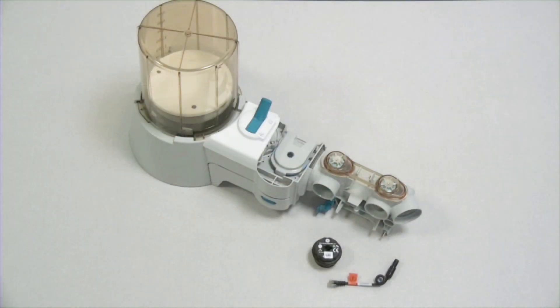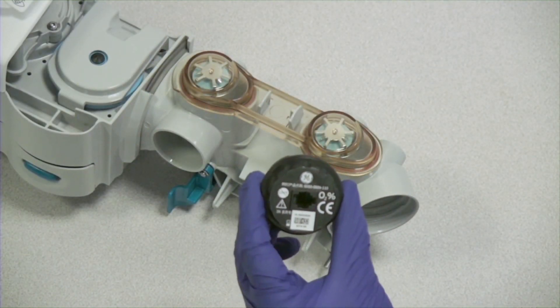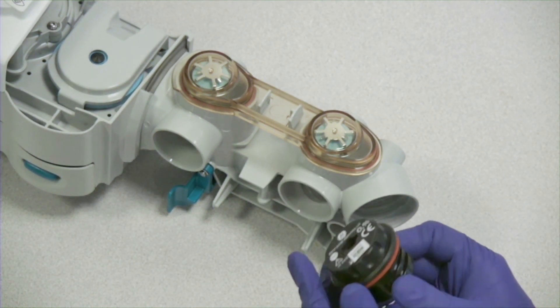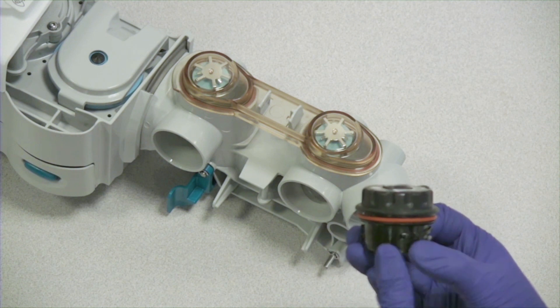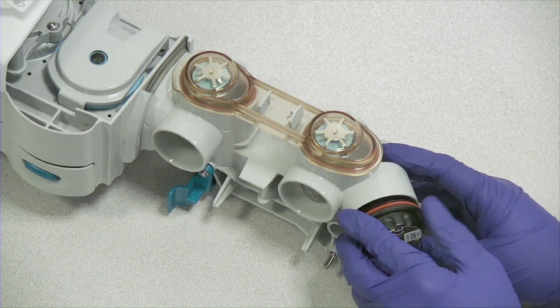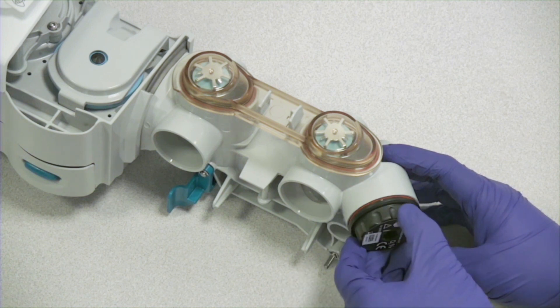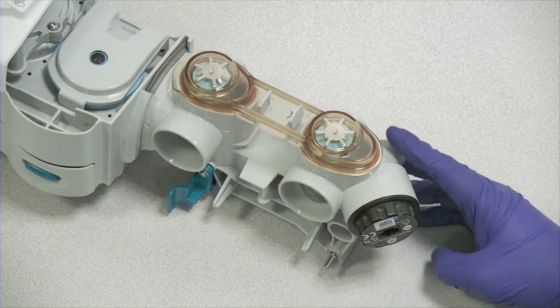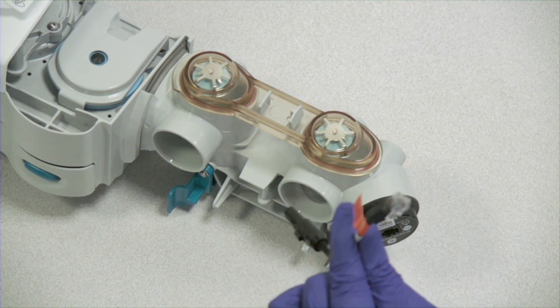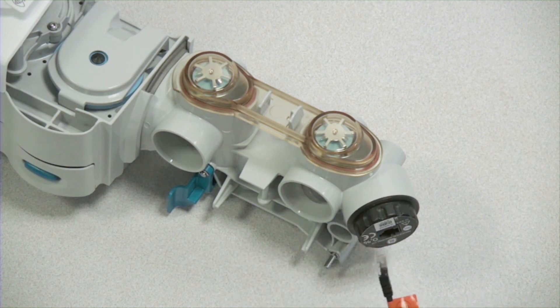With the bellows assembly and the breathing circuit module connected, we can replace the O2 cell. Take the O2 cell and make sure that the O-ring is in place. Replace the O2 cell by screwing it in clockwise. Next, connect the O2 cell cable to the O2 cell and into the breathing system.